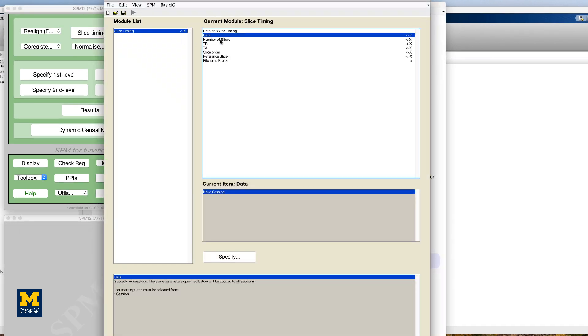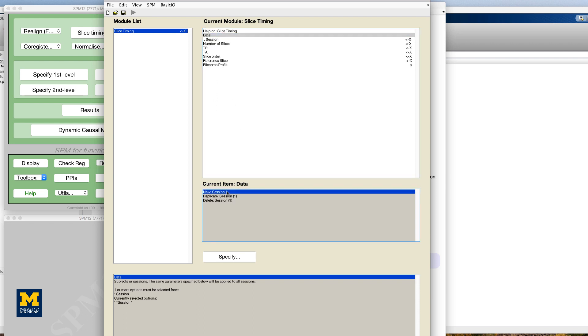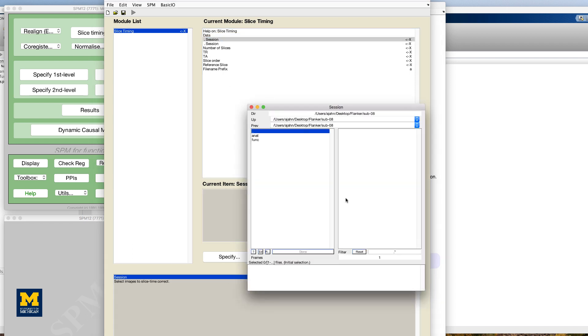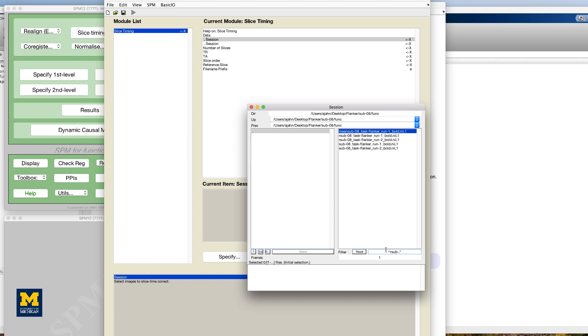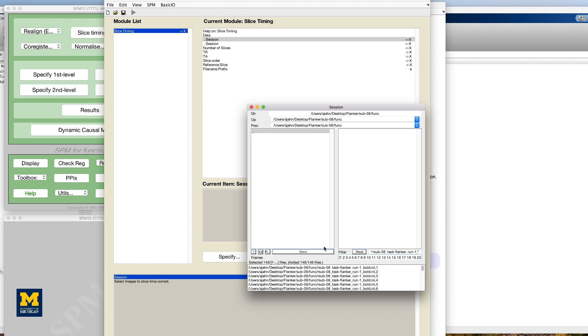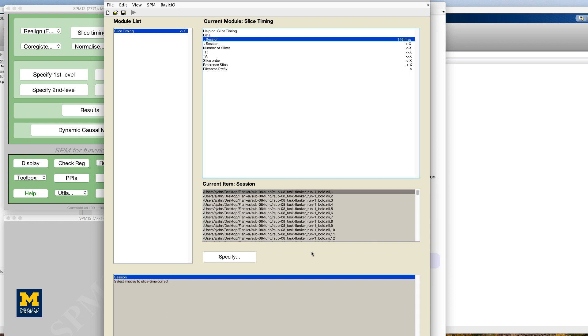Click on the data field and create two new sessions. Double-click on the first session and in the filter column type caret r sub dash 08 underscore task dash flanker underscore run dash 1. In the frames field, enter 1 colon 146 and press enter. Select all of the frames that are displayed and click done.